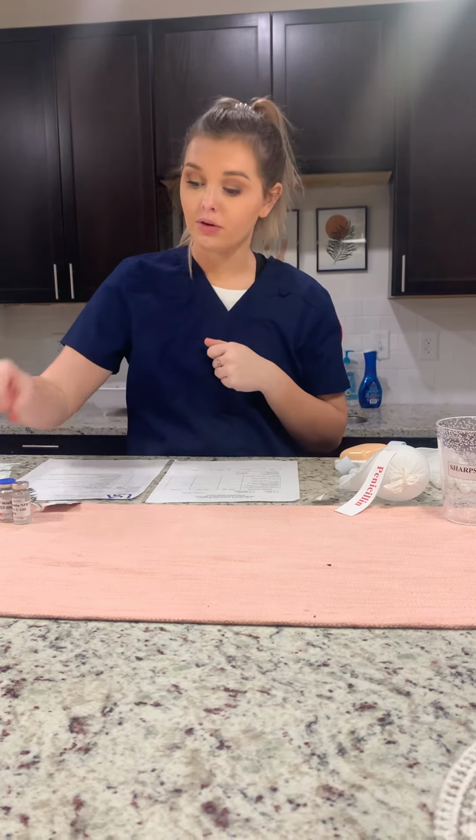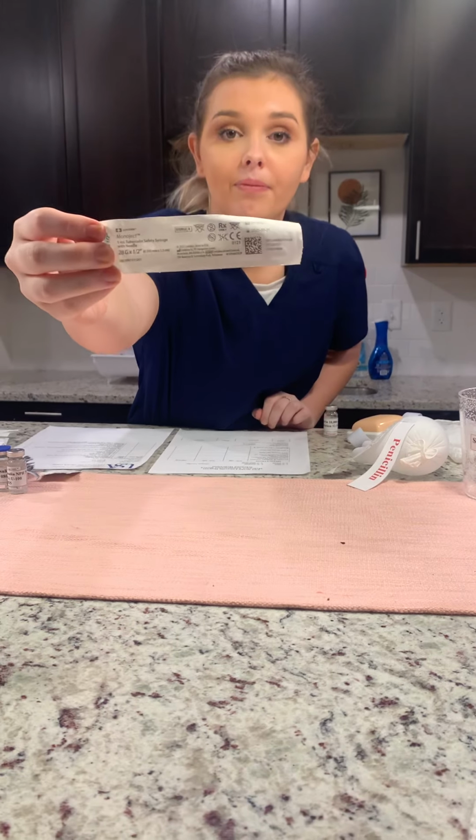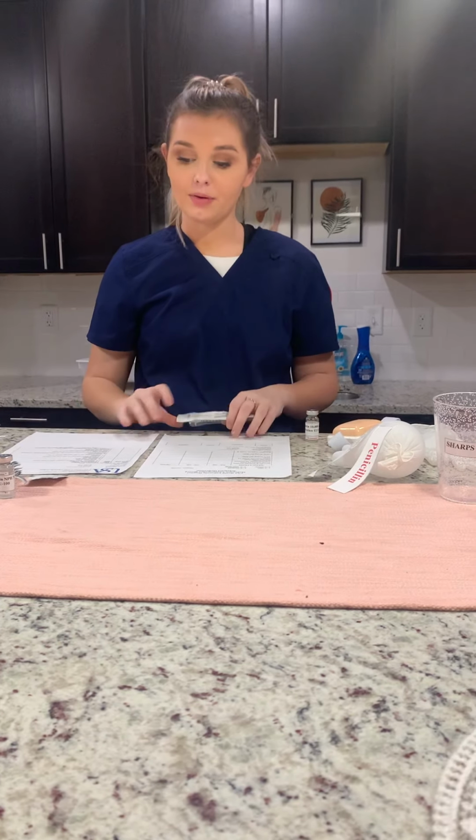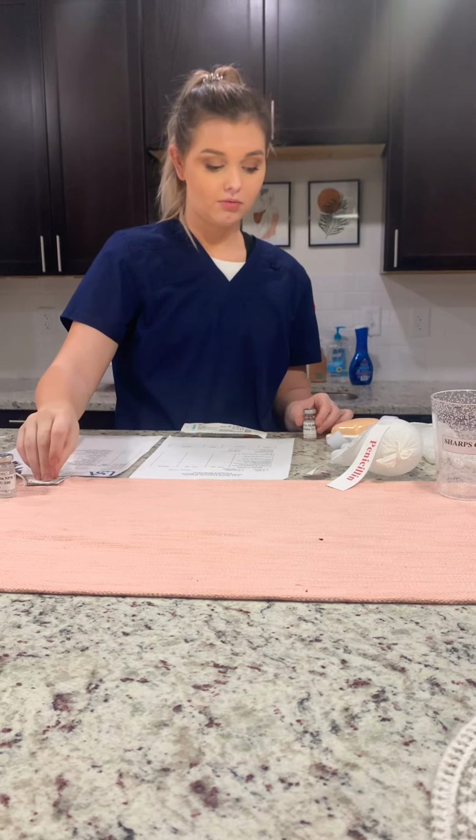At this time, I will perform hand hygiene. Since the order is for heparin, I have a vial of heparin right here. We will be doing it subcutaneously, so I will select the tuberculin safety syringe. It has been 12 hours since his last injection, so it is time for another one. This time I will clean the vial.